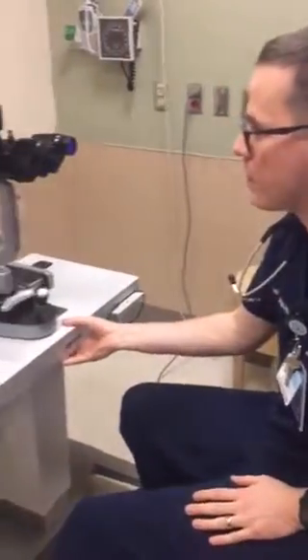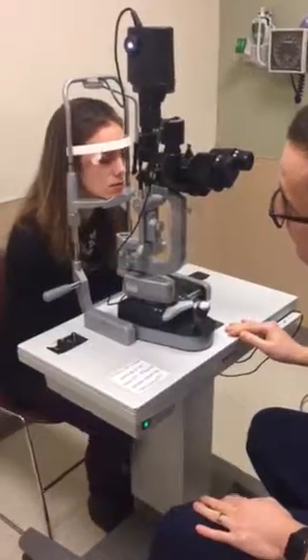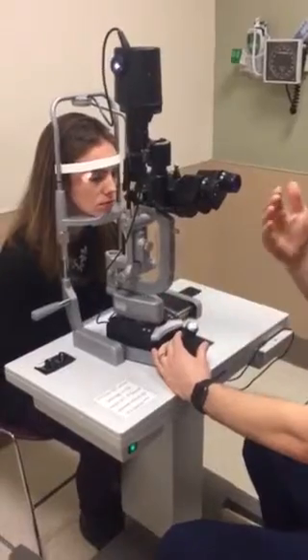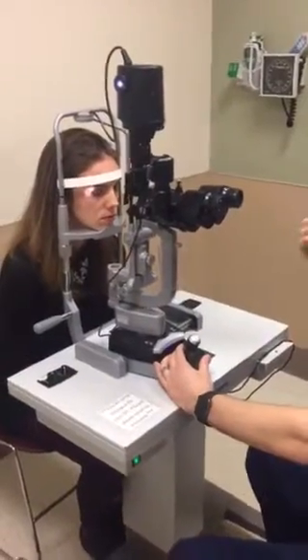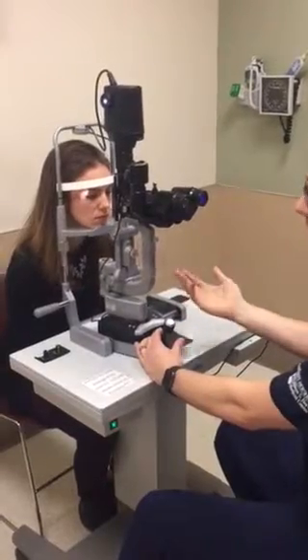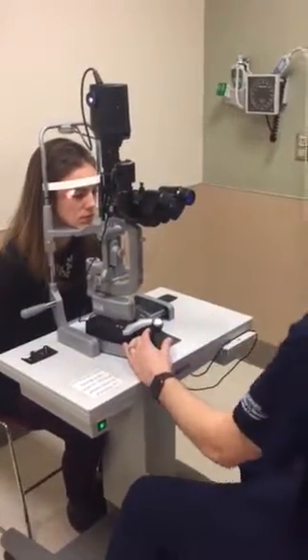Come forward, put your chin in the cup and your head against the white bar. As time goes on, patients have a tendency to have their head fall back off of the slit lamp. So if you're ever finding that you're out of focus, just make sure they're still chin forward and head forward.